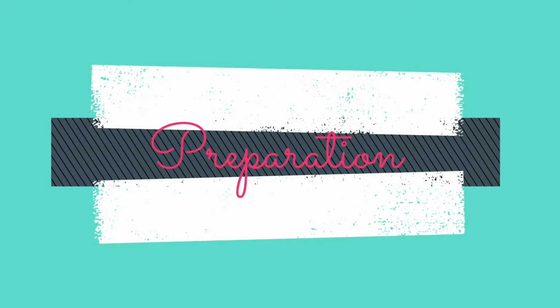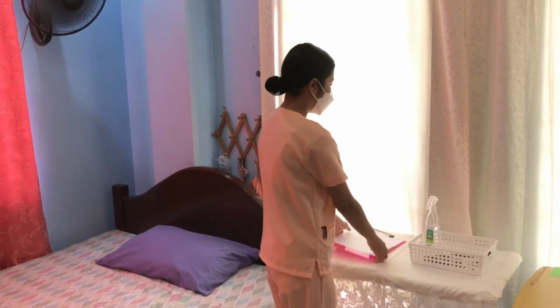Good day! I am Nicole Sumagaysay Colot from ESN 2B and I'll be performing antenatal abdominal examination, Leopold's maneuver, and auscultation of the fetal heart. Preparation. Check the doctor's order.